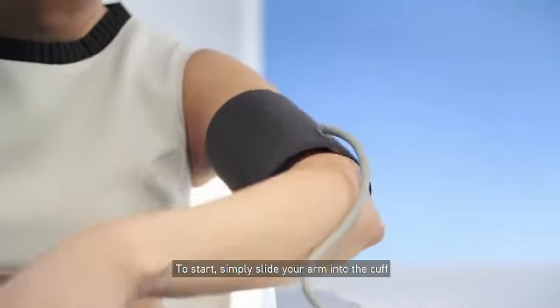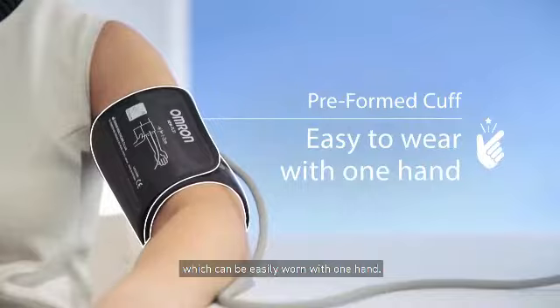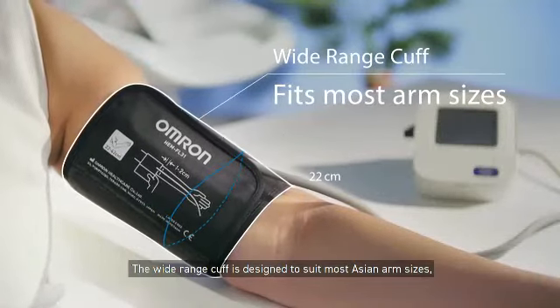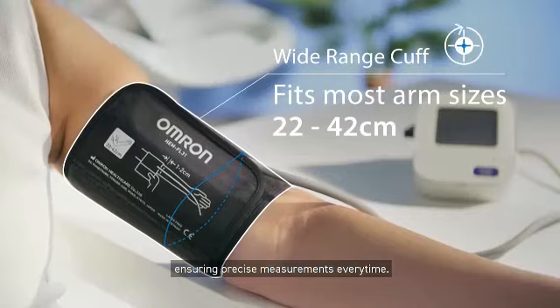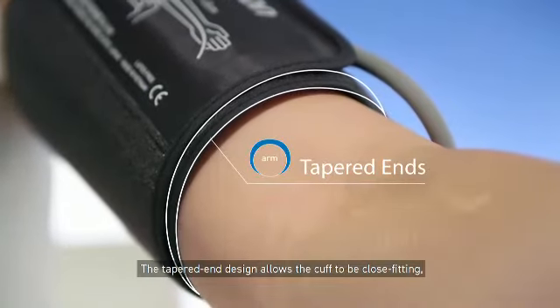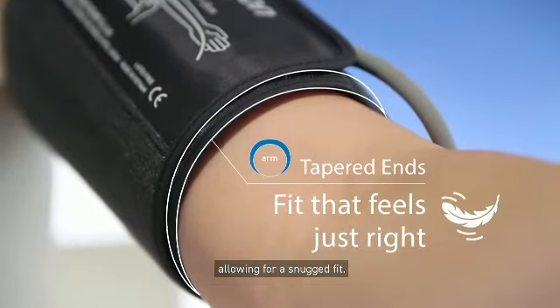To start, simply slide your arm into the cuff, which can be easily worn with one hand. The wide-range cuff is designed to suit most Asian arm sizes, ensuring precise measurements every time. The tapered end design allows the cuff to be close-fitting, allowing for a snug fit.